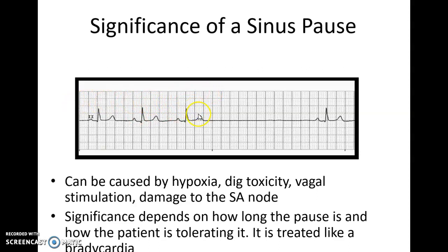To find out how long the pause is, I count the large boxes — it looks like almost 16 large boxes, so about a 3.2-second pause. So instead of saying I have a sinus pause — which only tells me I have a gap in my rhythm — I need to look at the underlying rhythm. I have a sinus rhythm at 60 with a sinus pause.